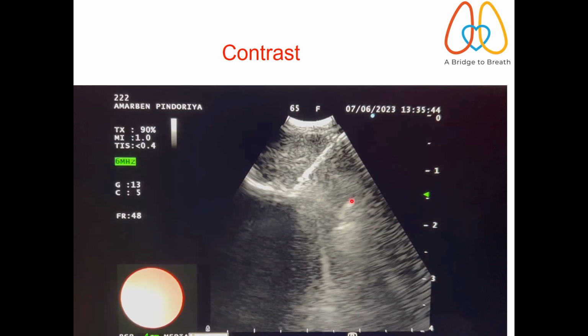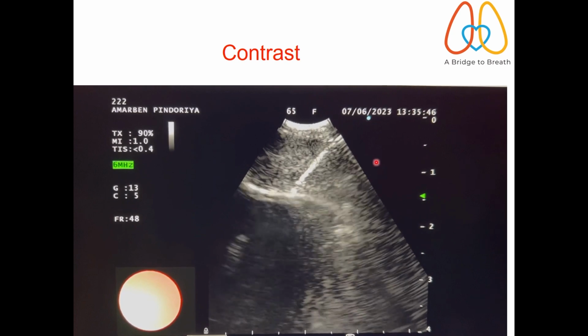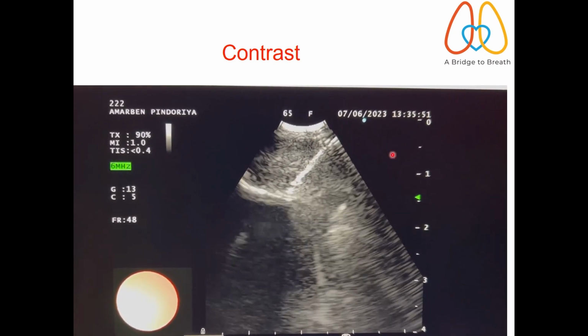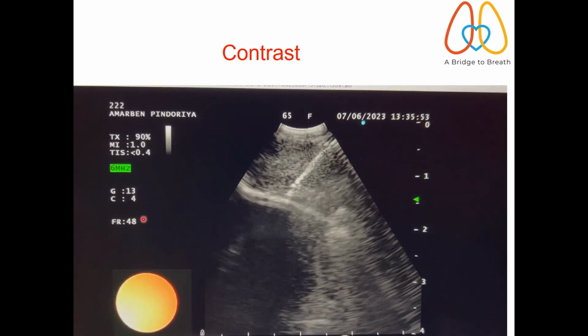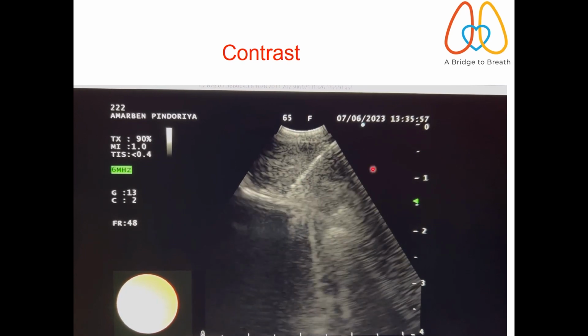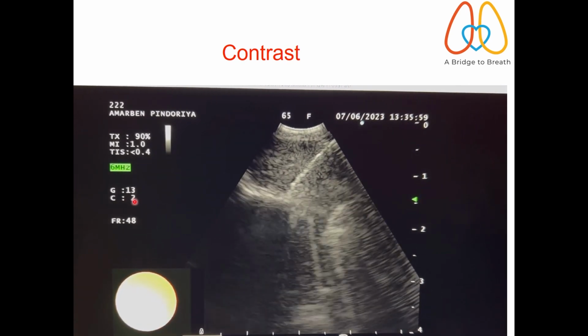Here you see how the contrast is going to change the echogenicity of the lymph node. So with the needle inside the node, the contrast is 2, the gain is 13.